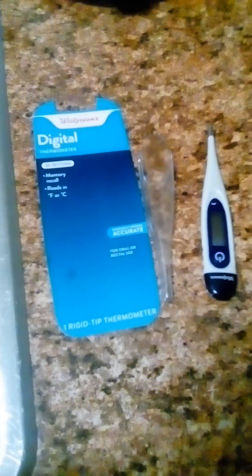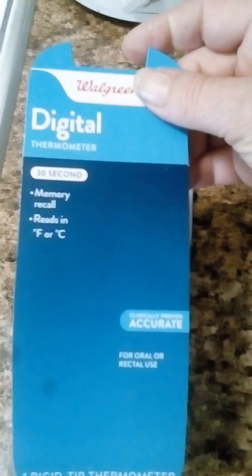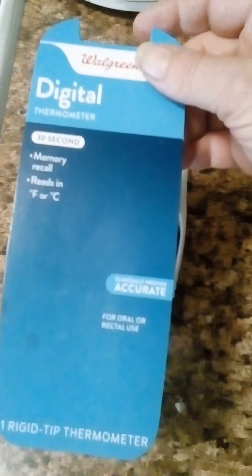Hey everybody, I'm going to do a quick review on the Walgreens digital thermometer. It gives you the reading in 30 seconds, and you can get it in Fahrenheit or Celsius, whichever you prefer.